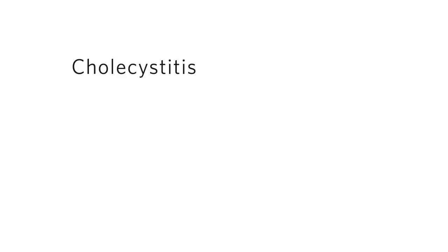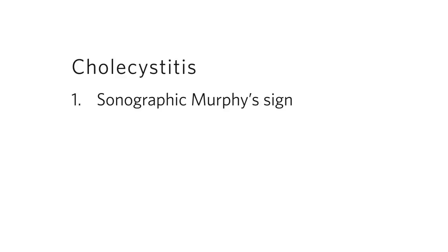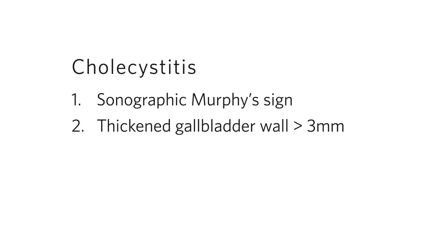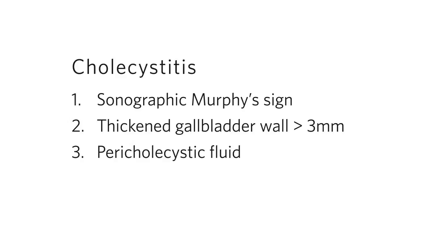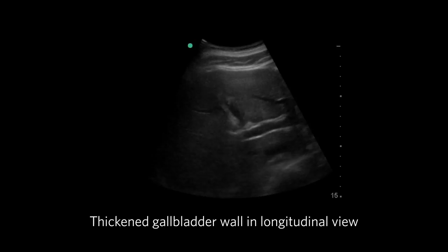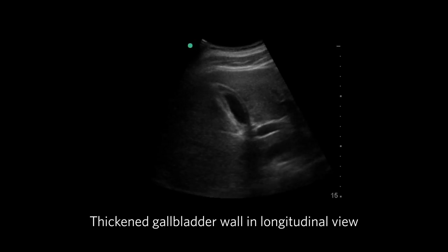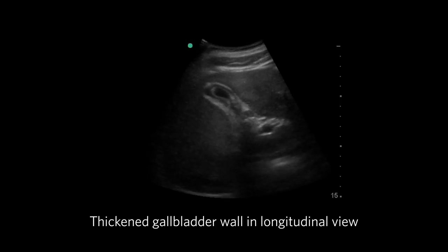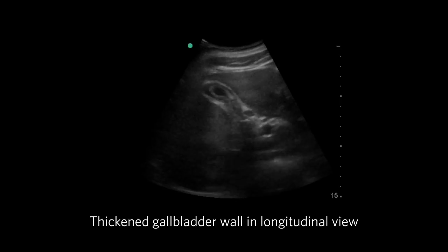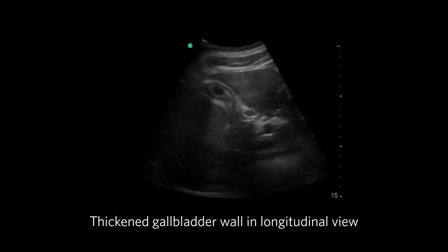Acute cholecystitis is a clinical diagnosis which includes your clinical judgment and the following POCUS findings: a positive sonographic Murphy's sign, anterior gallbladder wall thickness of more than 3 mm, and pericholecystic fluid. Remember, when measuring the gallbladder wall thickness, first position the probe so that you are imaging the gallbladder in the transverse or short axis orientation. A gallbladder wall thickness greater than 3 mm is considered abnormal and is a feature of acute cholecystitis.